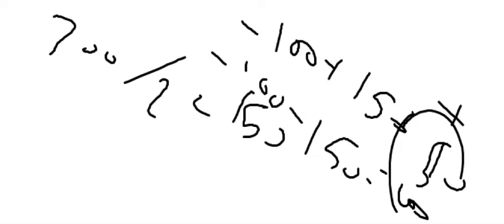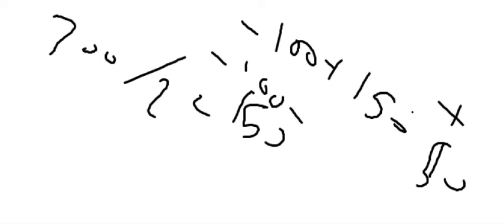Get it? Okay. Let's do another example. If I tell you I want a window width of 400 and a window center of 200. What do you say? 400 window width, center of 200. Between 400 and 0. Exactly. The center is 200, so 200 above, 200 below. So it will be from 0 to 400. Okay?